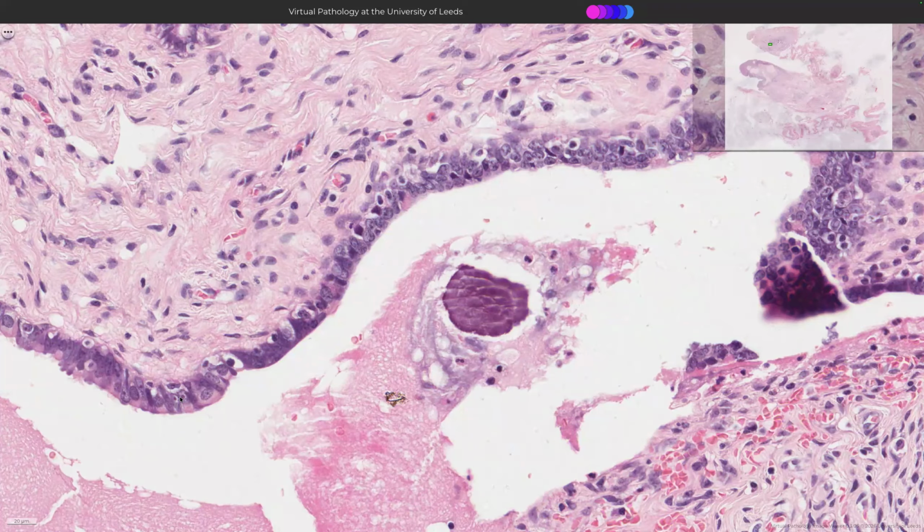And they aren't. So, I mean, these fallopian tube cells, they're pretty crowded, they're overlapping, they have little nucleoli, and that's completely normal. When they look atypical, they look like the wild things. They look like the serous carcinoma. What do you think this might be? There's two things it might be, and I can't tell which one it is.